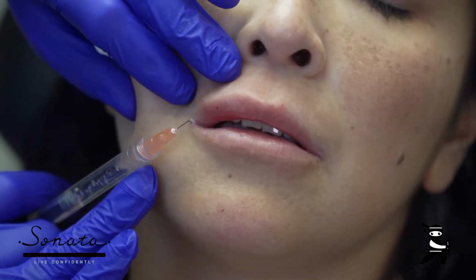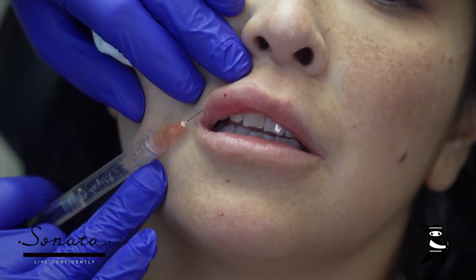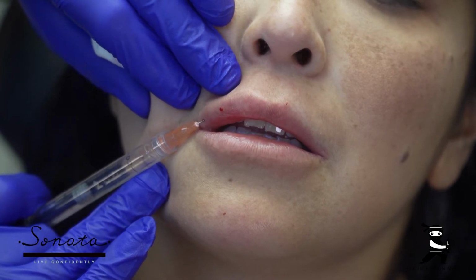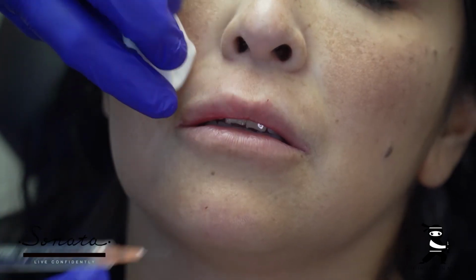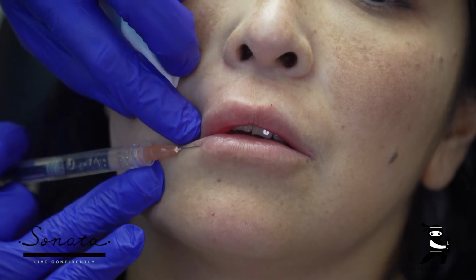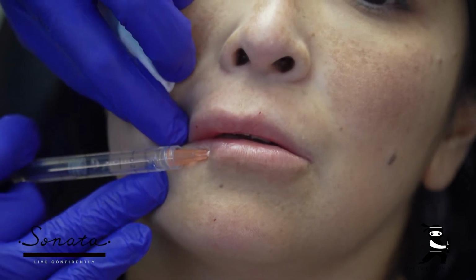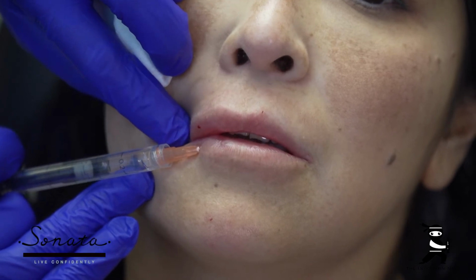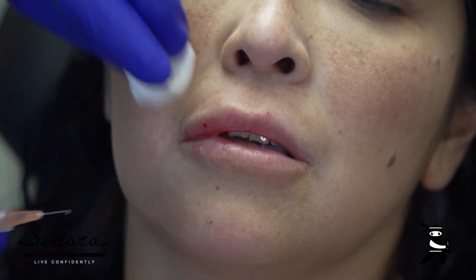I'm going to turn you this way. And again, we can move that tissue right onto the needle, just like that. And we do it quickly. I'm going to do some in the lower lip. Again, left hand's involved. It's moving tissue towards the needle, but we're also advancing the needle rapidly through the skin.